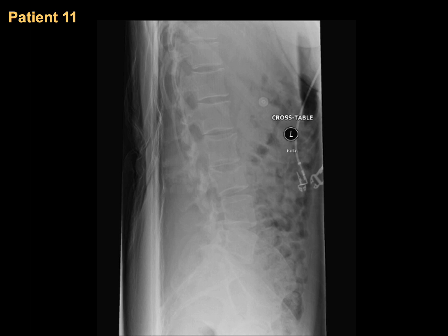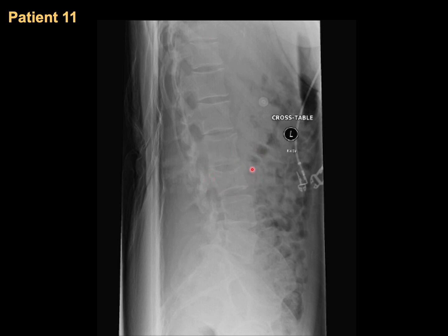Next patient is a male involved in a motorcycle crash with sensory and motor deficit in both legs and absent deep tendon reflexes. Counting from the sacrum: L5, L4, L3 — L3 shows a compression fracture. L2 is okay, as is T12. The conclusion is an L3 compression fracture.